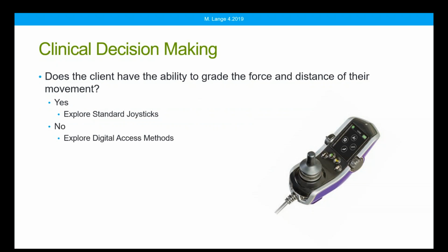So if the client does have the ability to grade the force and distance of their movement with their arm, they should be able to use a standard joystick. If not, we may have to explore other options, including digital access methods.